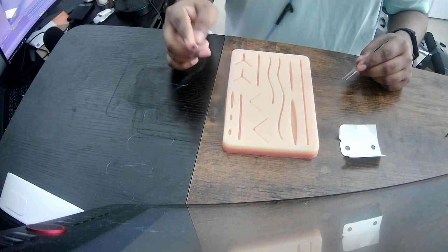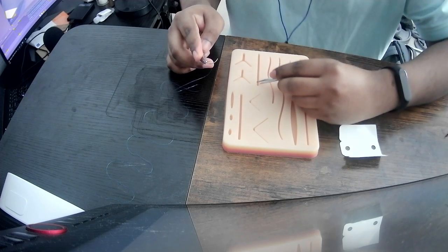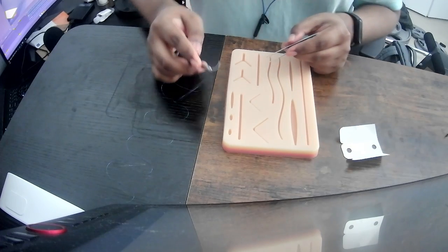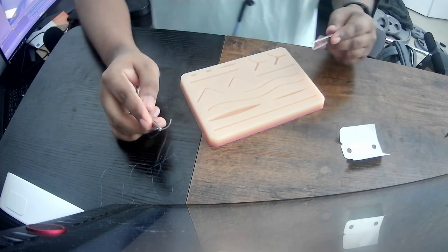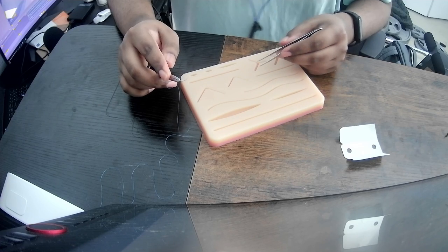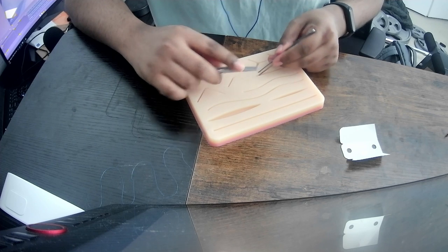As we start practicing, when you're doing this at home, you should be doing this standing up, straight back. It's difficult, I know, to start, but that's how you're going to do it in the operating room. I'm leaning in because of the camera, but don't pick this up as a bad habit, because you will really hurt your back if you're always hunched over like this.